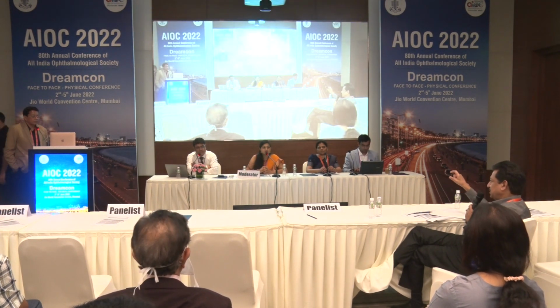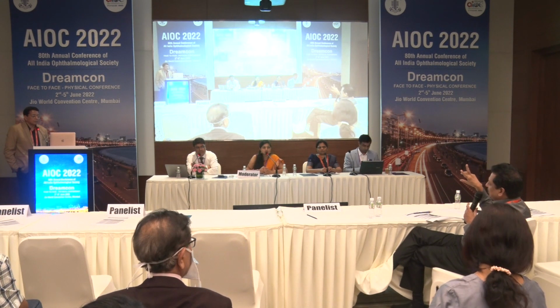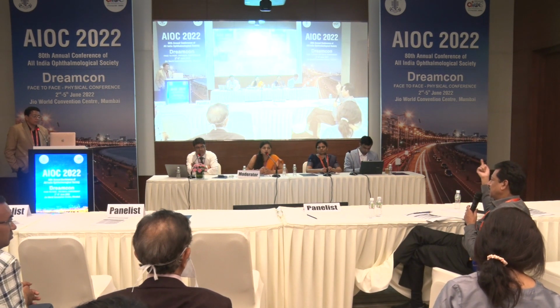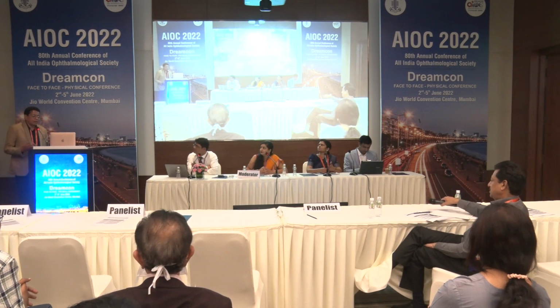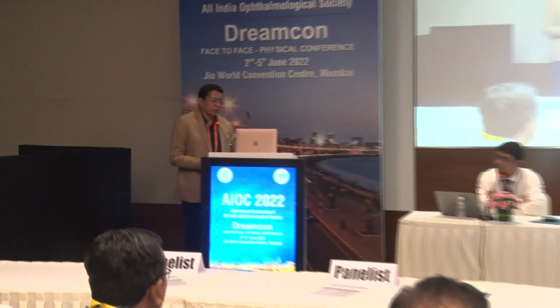5-6 degrees between machines. And whenever we do a toric calculation, we pick up the two most reliable systems and then ensure that the difference is not more than 3 degrees. If it is not within 3 degrees, we ask them to do it again. Repeat, repeat, repeat till you are within 3 degrees. And then we use that value. I quite agree with you. There's really not much sense in doing multiple instruments, unless it's an irregular cornea or something. Whatever equipment you have understood well, and especially if it's an optical biometer, they have fairly repeatable K readings as well as axial length measurements. You can go with that.